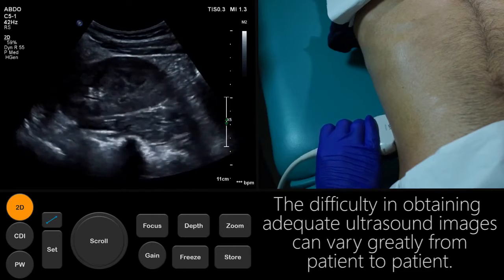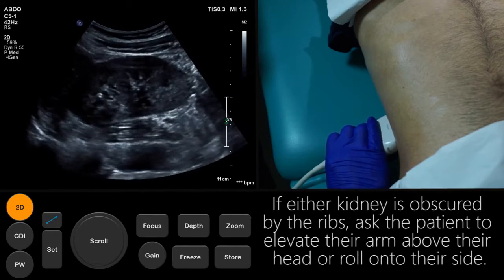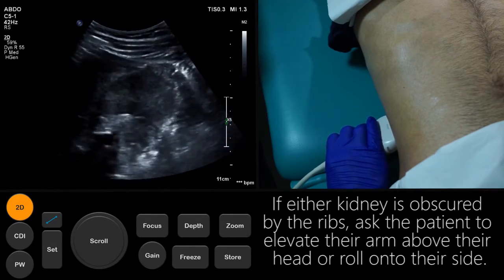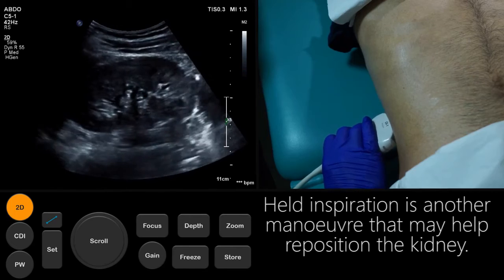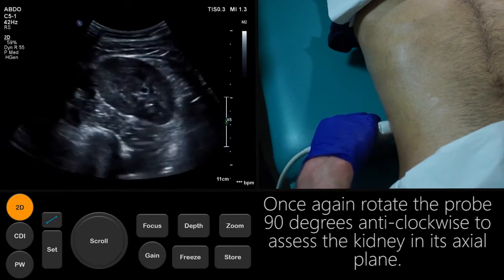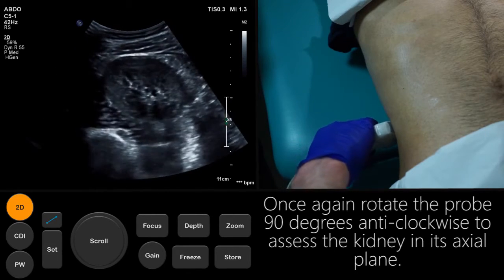The difficulty in obtaining adequate ultrasound images can vary greatly from patient to patient. If either kidney is obscured by the ribs, ask the patient to elevate their arm above their head or roll onto their side. Held inspiration is another maneuver that may help reposition the kidney. Once again, rotate the probe 90 degrees anticlockwise to assess the kidney in its axial plane.